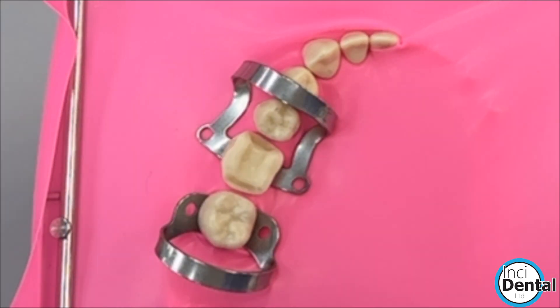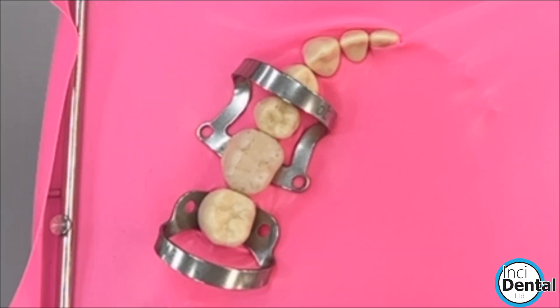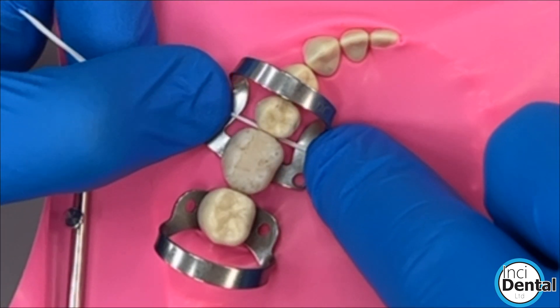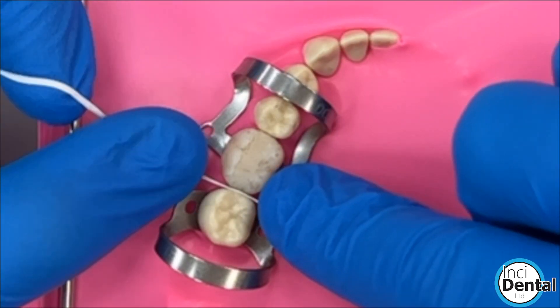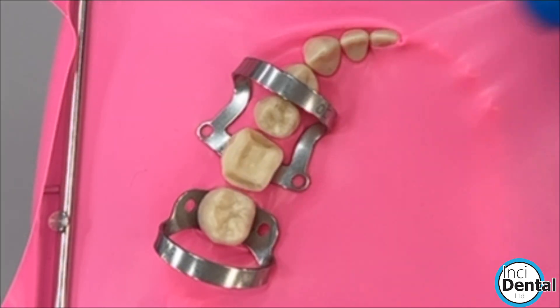You can quite easily place your overlay, and the beauty of this clamp over other accessory clamps is you still have plenty of room to floss. The key is you can floss all the way down to the bottom of the contact to remove the excess cement, which is really important when you're doing an overlay cementation. Bags of room and easy to work with.